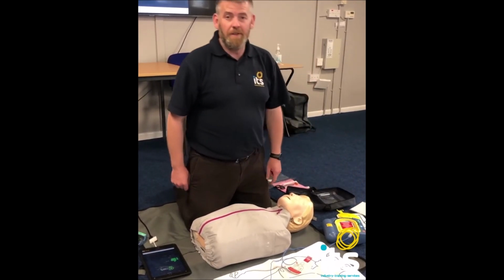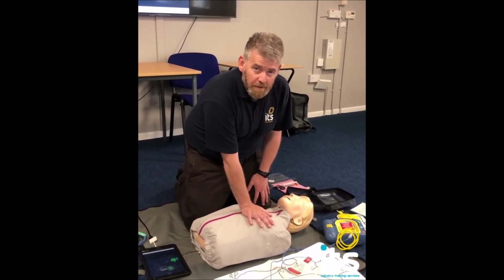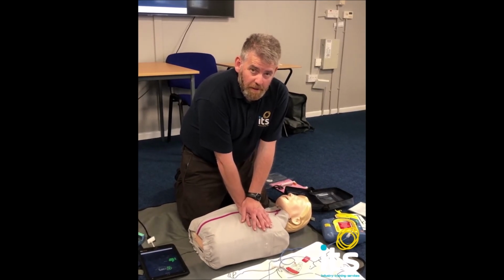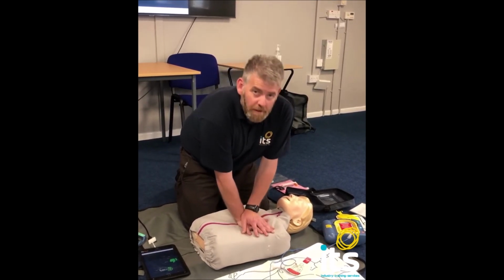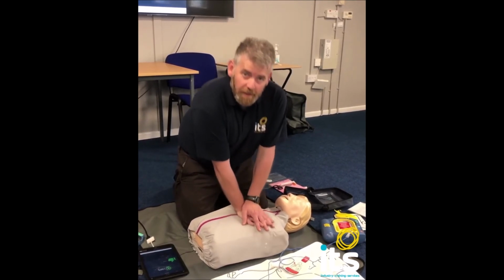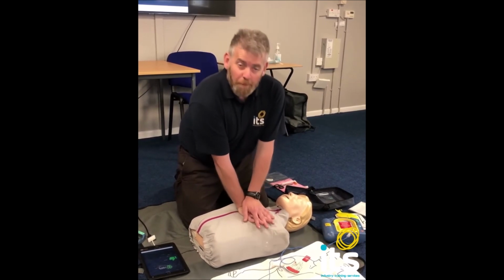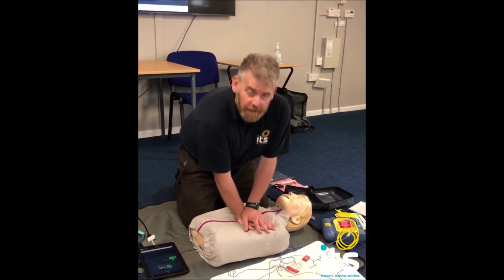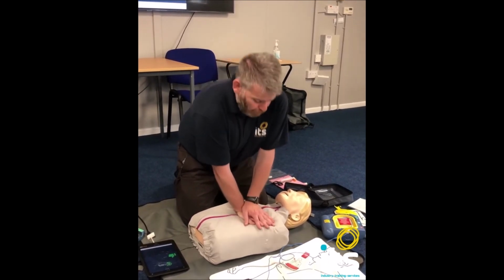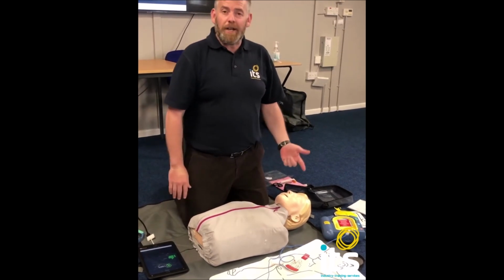Place the heel of one hand in the center of the chest between the nipples. Place your other hand on top of the first. Push the chest down firmly 5 centimeters. The machine will give you a rhythm to stick to, and it even counts to 30. This is the benefit with these machines. When people talk about plug and play, it's an activated voice, nice in a calm manner, and it tells you what to do. And you'll put through approximately 5 rounds of CPR, and then the machine will reanalyse again.